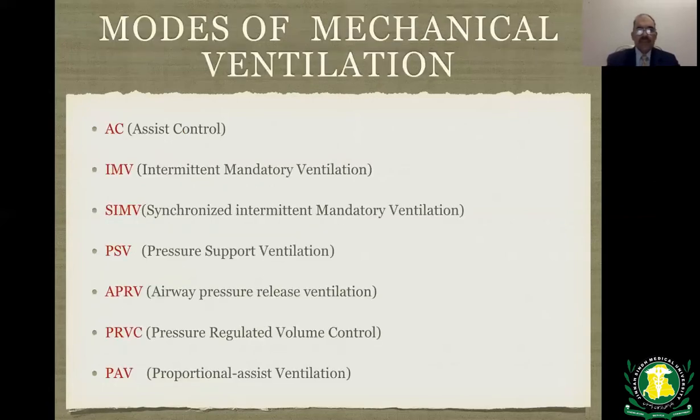Modes of mechanical ventilation include AC (assist control), IMV (intermittent mandatory ventilation), SIMV (synchronized intermittent mandatory ventilation), PSV (pressure support ventilation), APRV (airway pressure release ventilation), PRVC (pressure regulated volume control), and PAV (proportional assist ventilation).